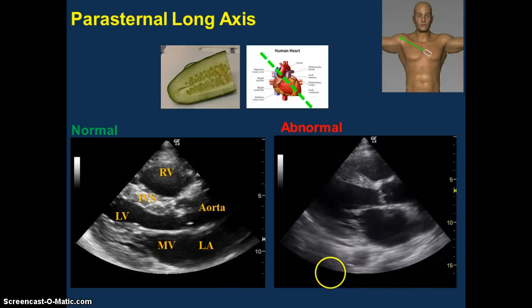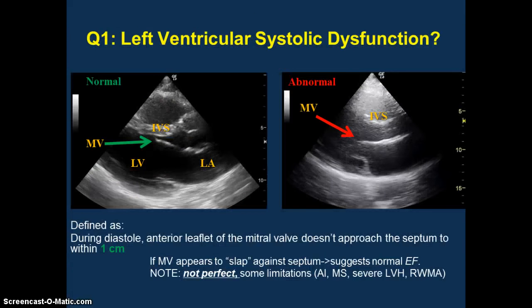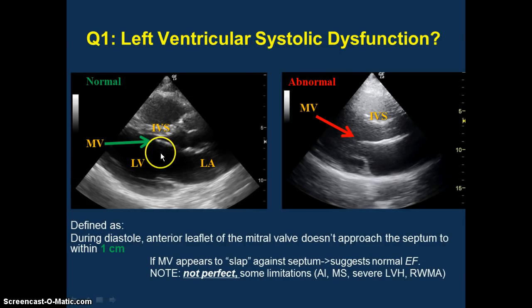Even if you don't have any echocardiography experience, you can tell this is a normal heart, and this is obviously a very sick heart. We're going to pay attention to only two things with regards to these echocardiograms. We're going to look for evidence of left ventricular systolic dysfunction, and our surrogate marker for that is going to be focusing purely on the anterior leaflet of the mitral valve. We're going to look to see whether or not it approaches the septum during diastole — the key number to remember is one centimeter.